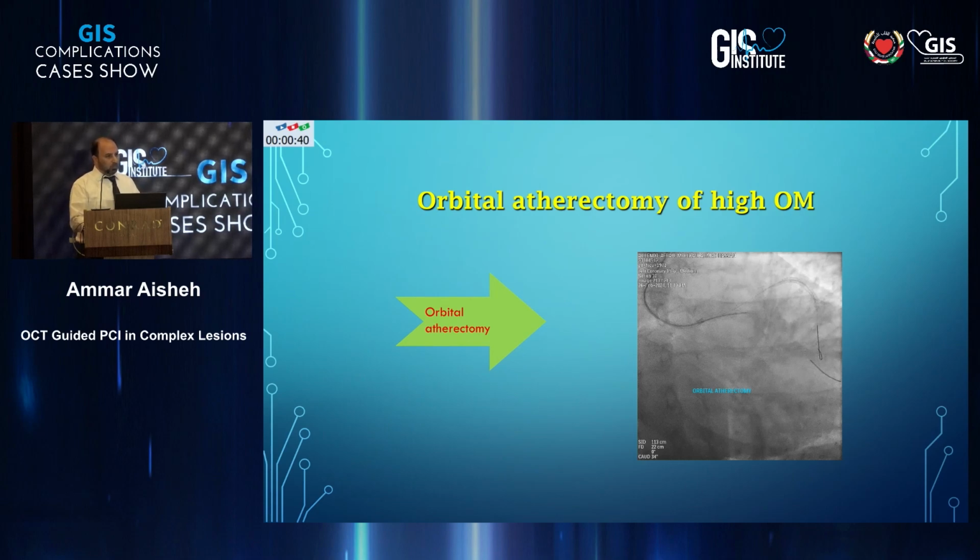Laser may be an option. You can anchor with the new stent if you want, change your guide, have a bigger guide. And then we can talk about OCT and calcifications. Yes. Thank you. And I think that's a great algorithm.